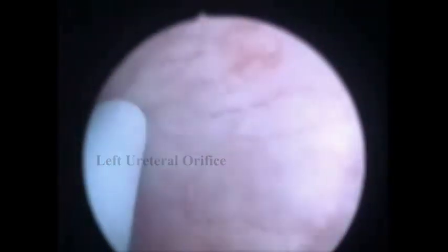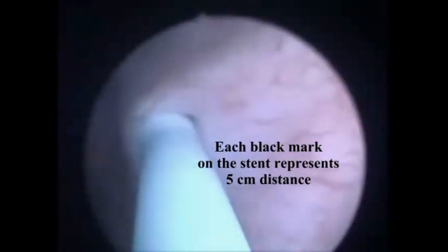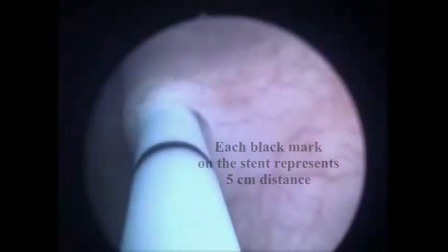Stents are often necessary to help the surgeon locate the ureter, which sometimes cannot be seen or palpated at surgery. Kidney stones, which can block the ureters, are often removed and then stents placed afterwards to keep the ureter patent.